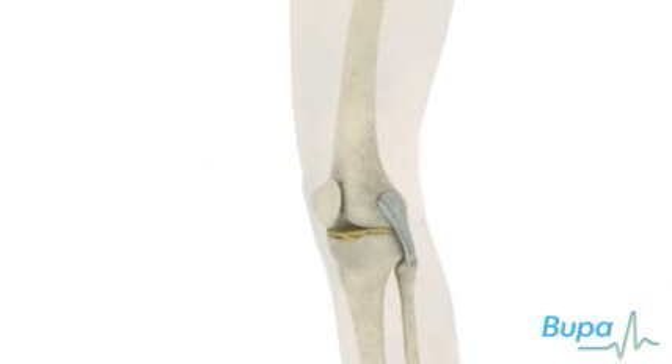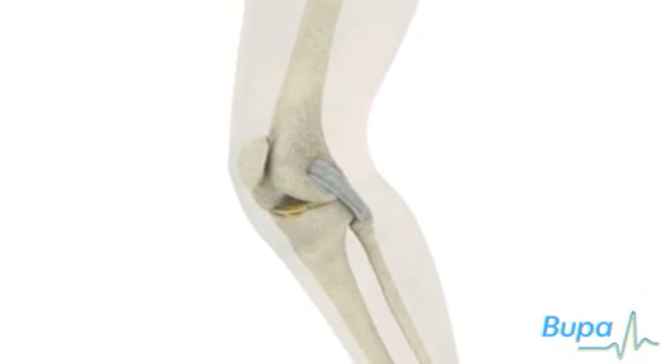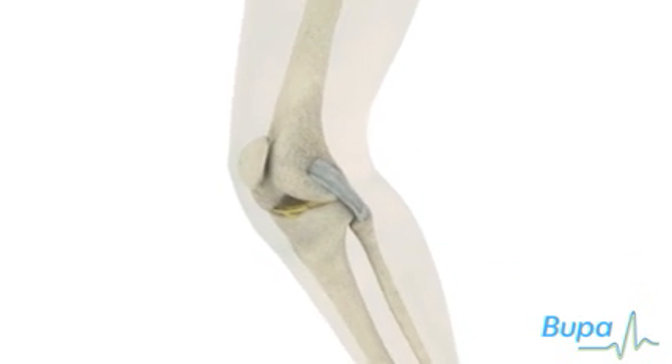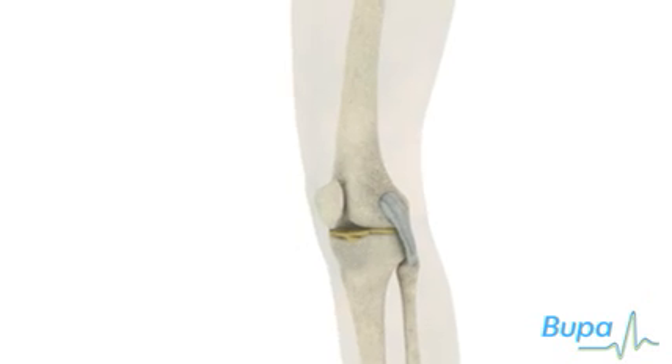Arthroscopy is used to examine the knee to help diagnose problems. It can also enable surgeons to treat a variety of knee conditions and injuries.